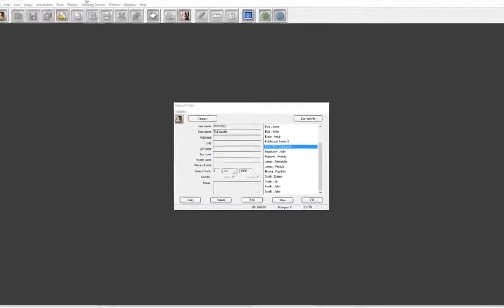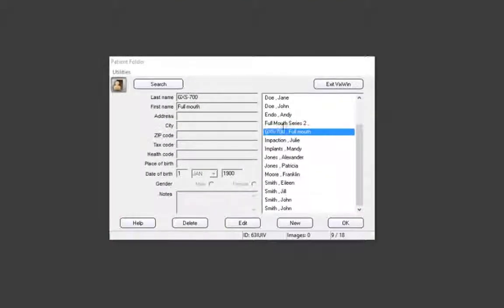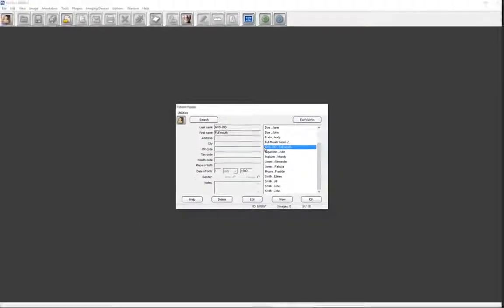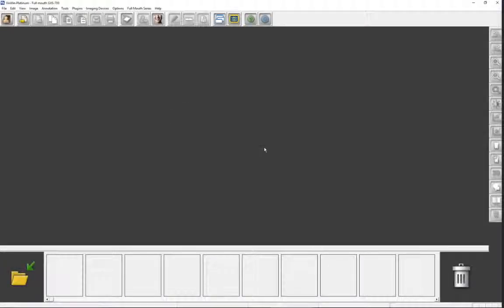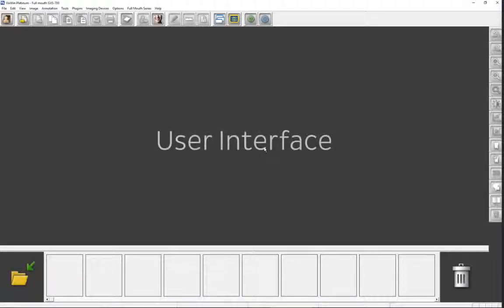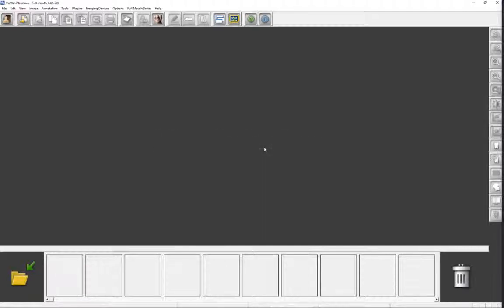Vixwin will open to the patient folder. When a patient record is double-clicked on, or the record is clicked on and OK is clicked, you will be transported to the user interface. This video will only concentrate on capturing images from a digital X-ray sensor for automatic or manual insertion into a predefined mount.